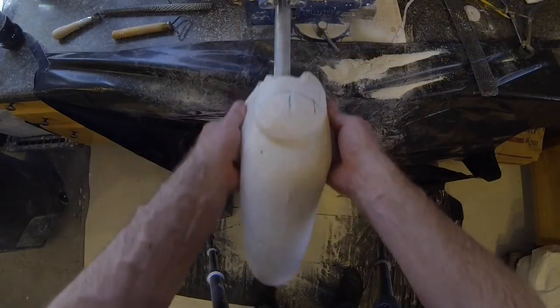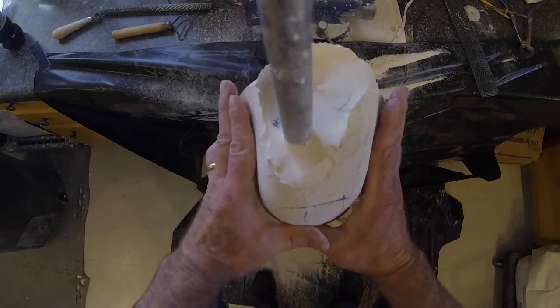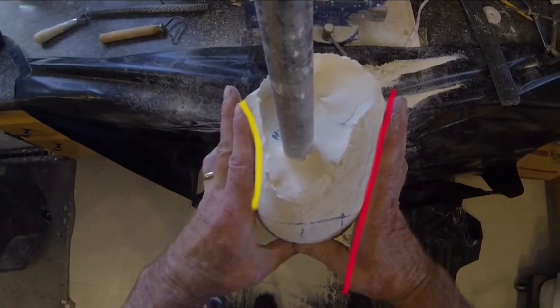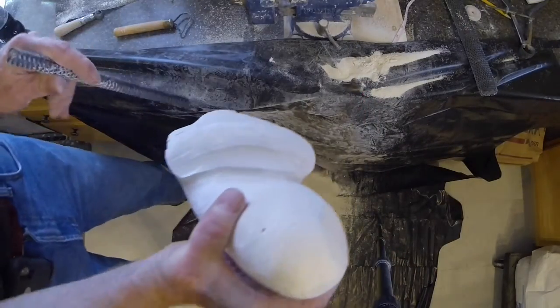Generally, the proximal level will be slightly smaller than the measurement taken on the residual limb. Distal levels will be equal to the residual limb measurement. These tension values vary with tissue consistency, residual limb length, and the type of suspension desired.